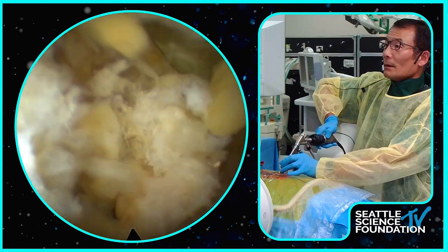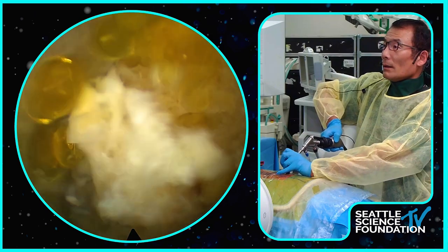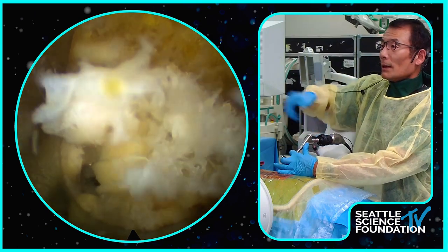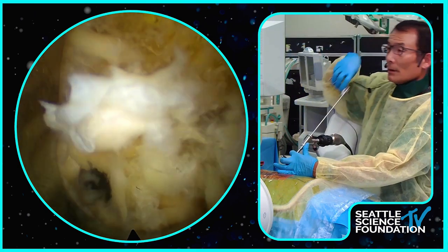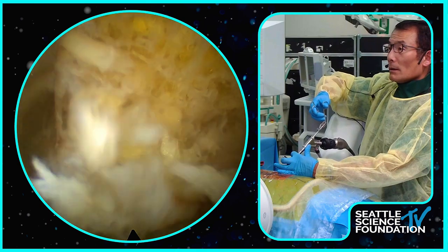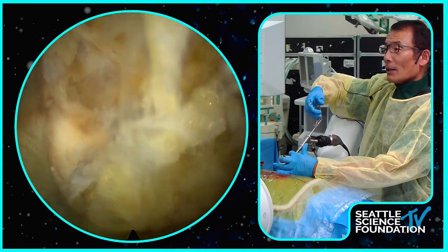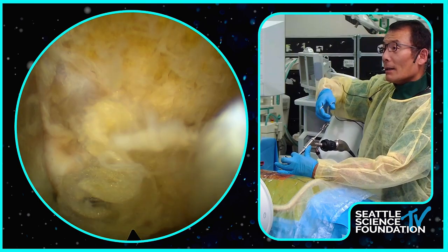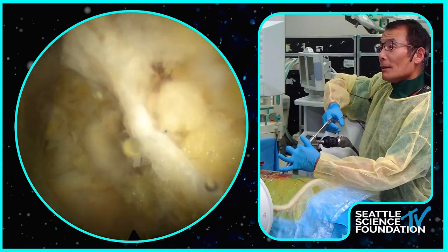Chung, what drill bit do you use for that? Because it's a lot of bone resection. Do you use a cutter there, or do you use a drill? I use a drill. Let me take out some of the fragments. What type of drill? Is it like a diamond drill bit? No, I use the side cutting olive cutter. Okay, thank you.